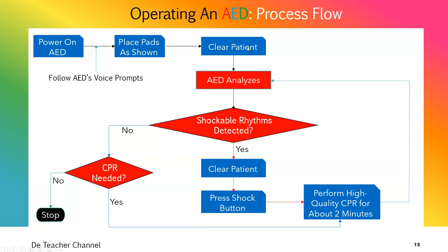The reason is that if somebody else is touching the patient while the analyzing is happening, the AED is going to pick up that other person's heart reading and then give you a wrong result. So a few seconds after analyzing, the AED will give you a result, the outcome, the finding.